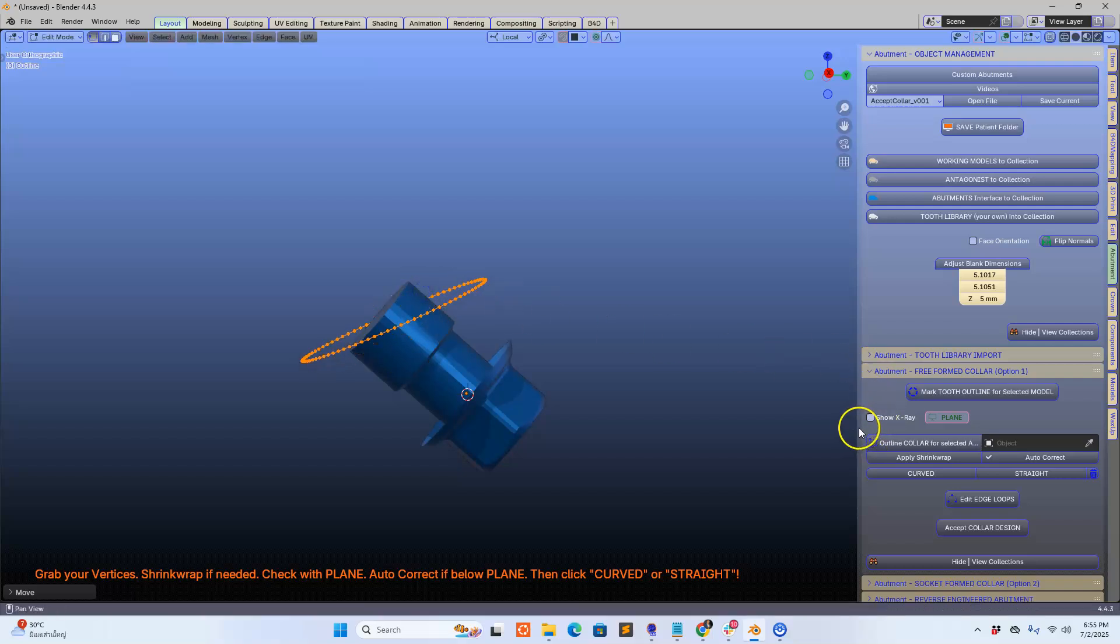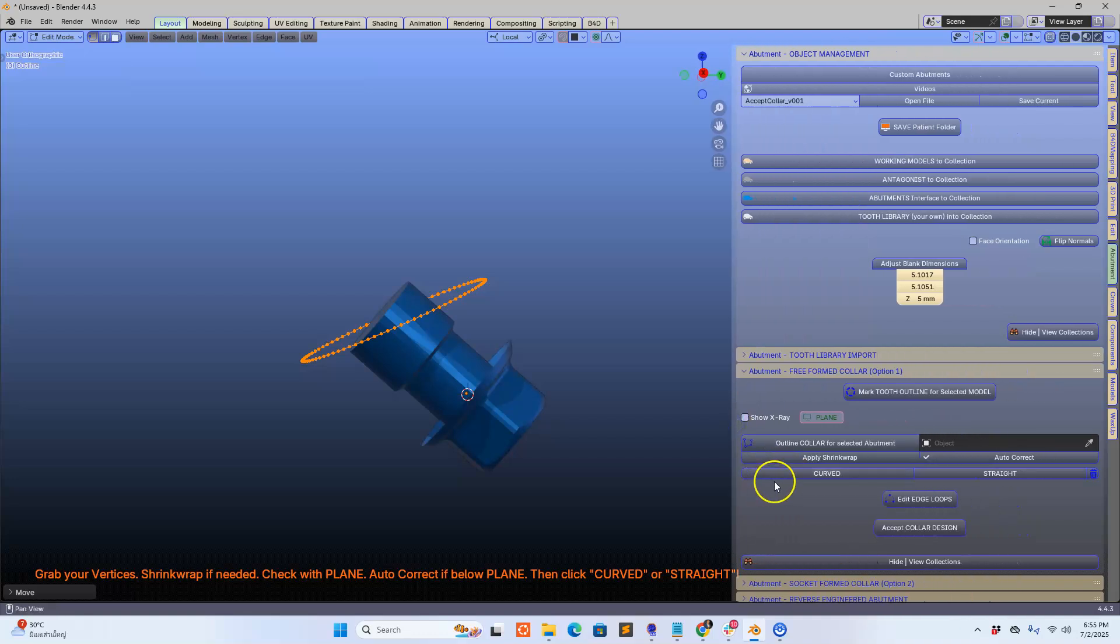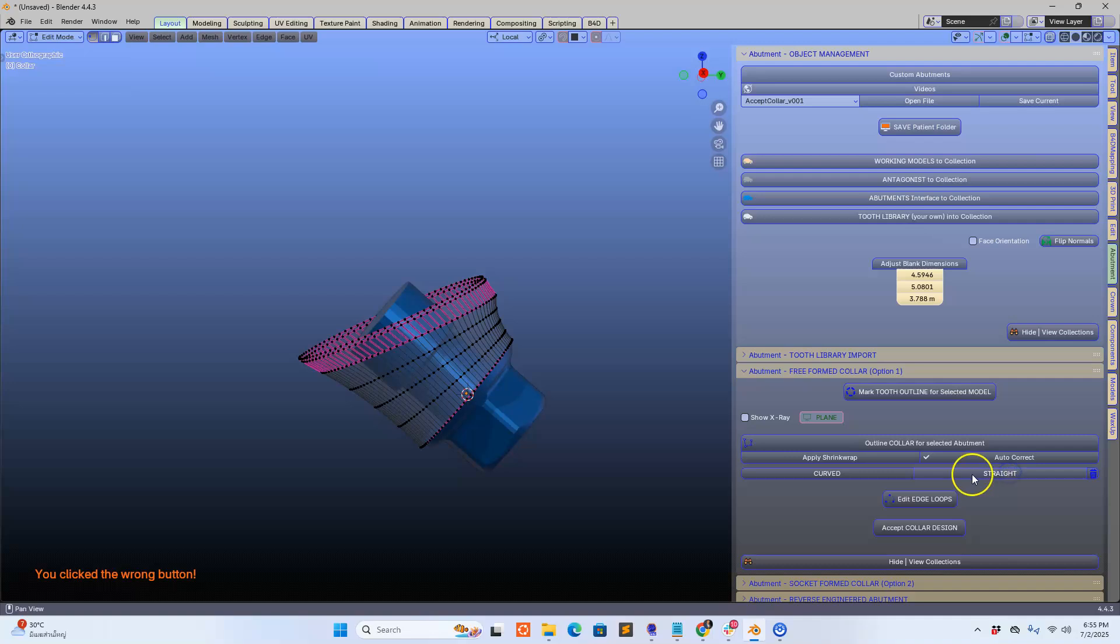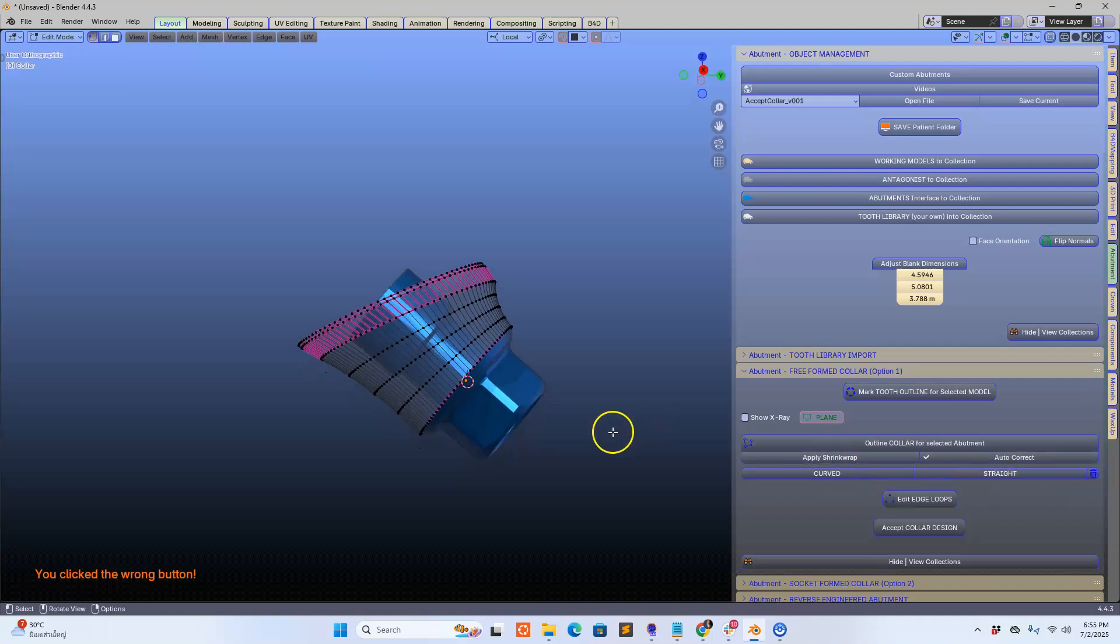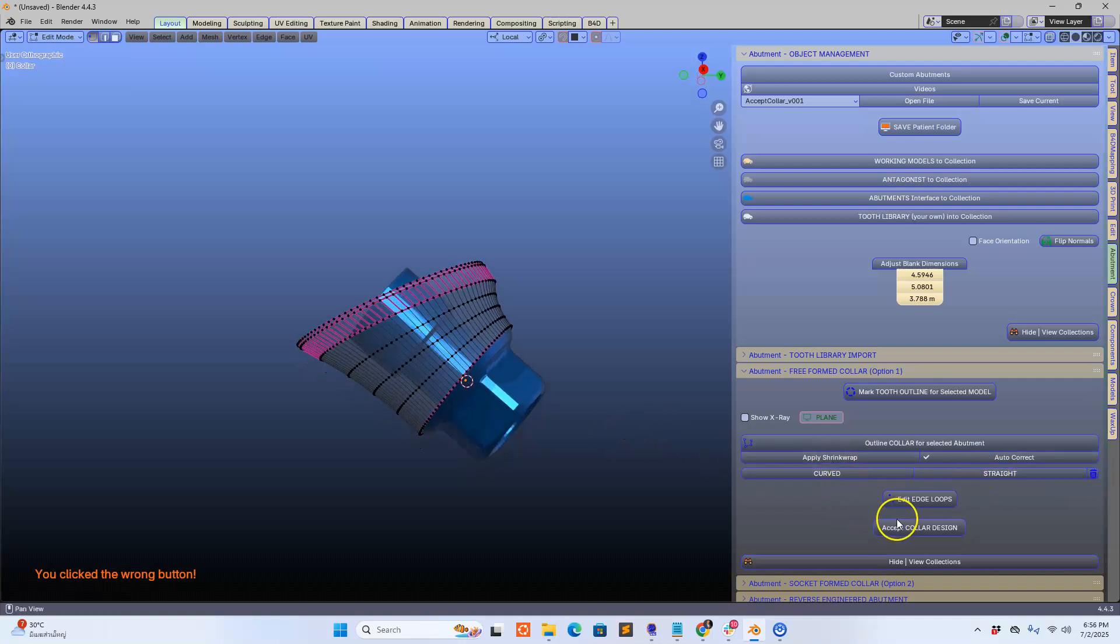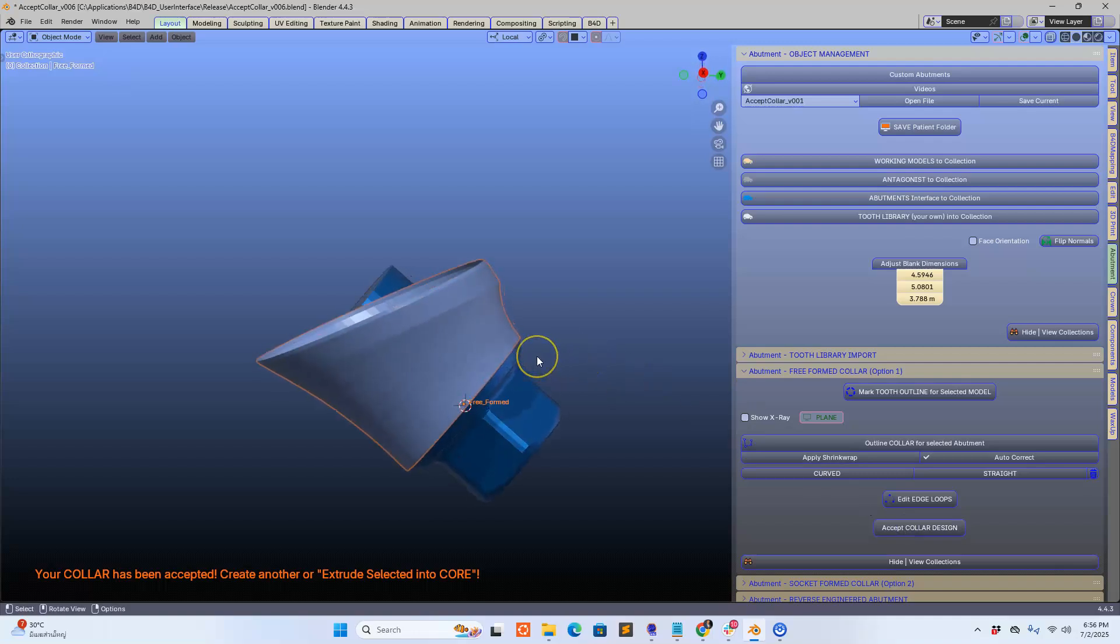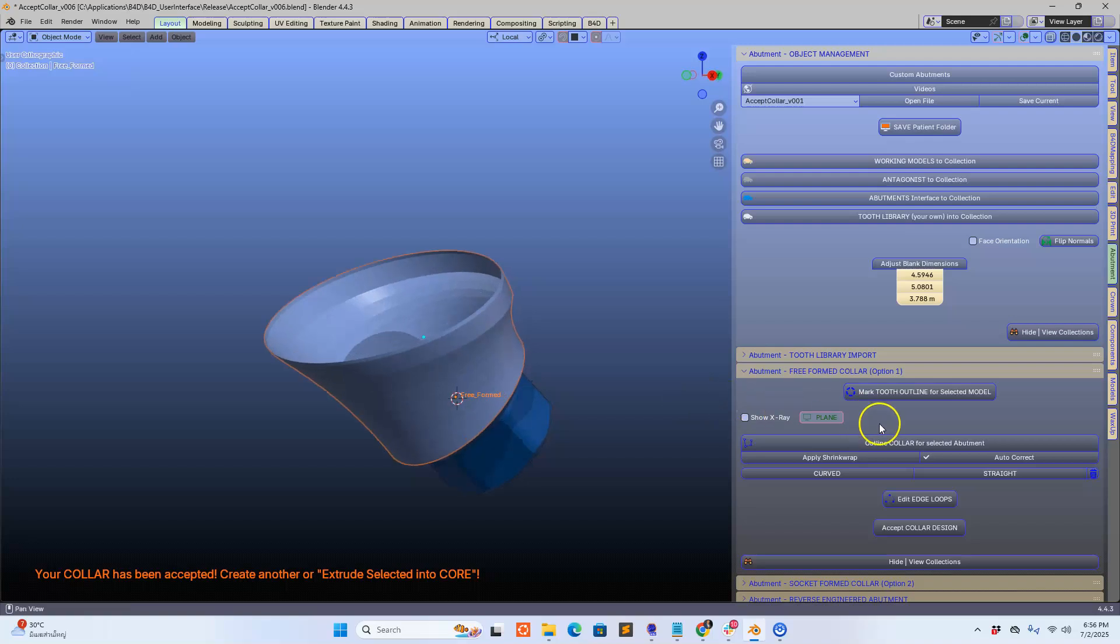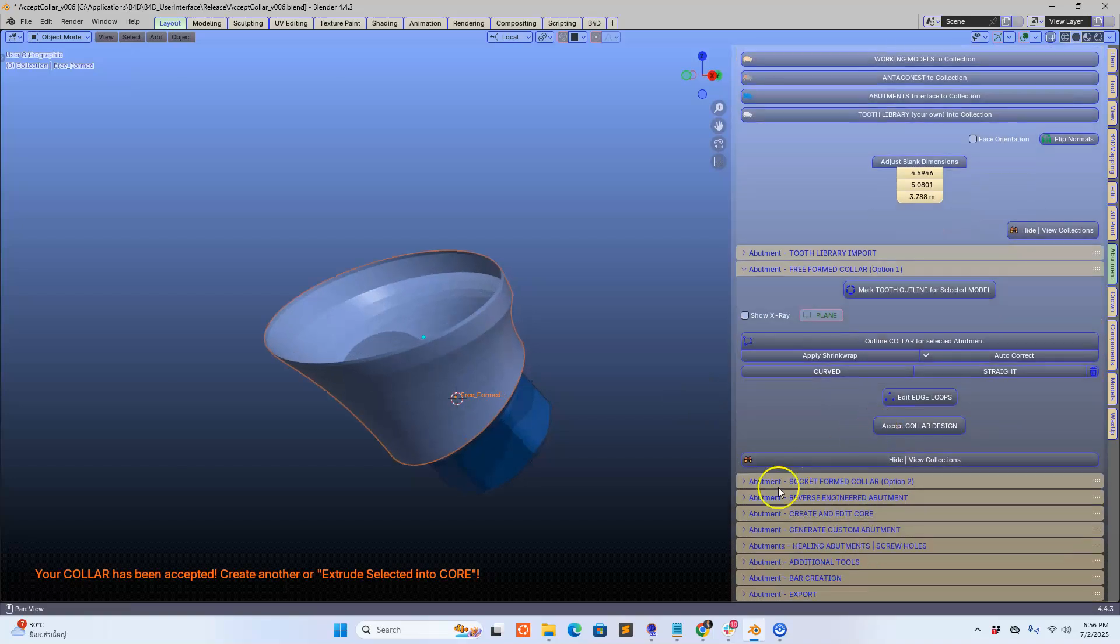I'm going to create a curved surface like that. You can also use a straight surface if you want to or a curved surface. So we'll just leave it as curved. We're going to accept this collar and now we have to extrude this towards us, similar to the I-bar scenario.